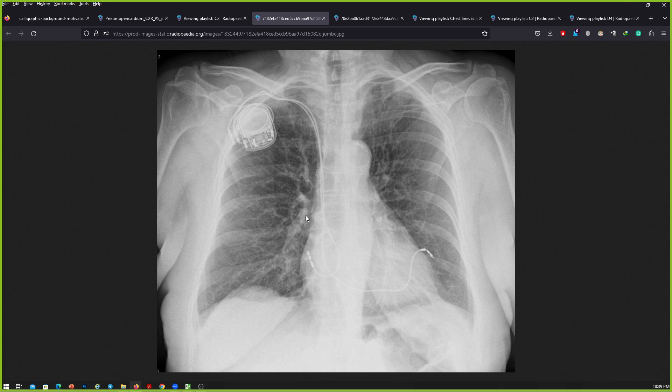Other than that, I can see bilateral lung parenchyma shows reticular opacities. I'll urgently inform the cardiac team regarding the same and also alert the referring physician.